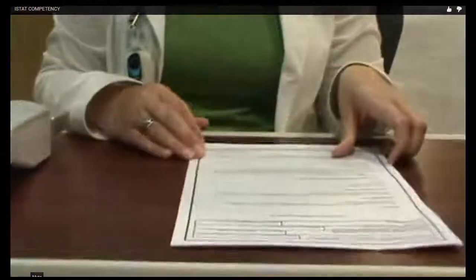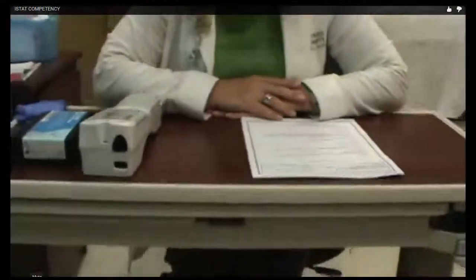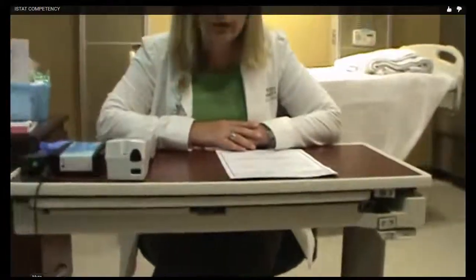We'll talk a little bit about the iStat cartridges, what tests are available on those, when the appropriate time to use them is, what the specimen type is, etc. By the way, the simulator takes about 120 seconds, about 2 minutes. Most of the tests on this take only about 2 minutes, so especially at night, this can be useful if you're really needing some results in a quick hurry on a patient.